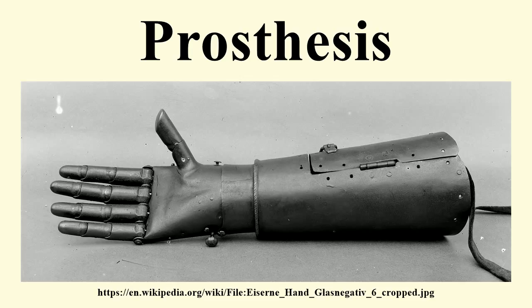Lightweight, high-strength thermoplastics are custom-formed to this model of the patient. Cutting-edge materials such as carbon fiber, titanium and Kevlar provide strength and durability while making the new prosthesis lighter. More sophisticated prostheses are equipped with advanced electronics, providing additional stability and control.